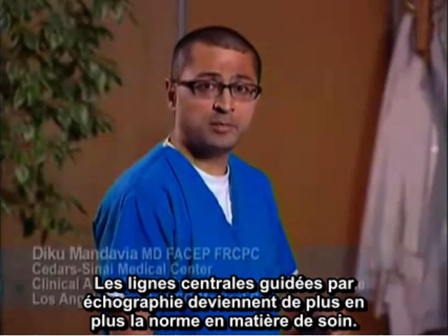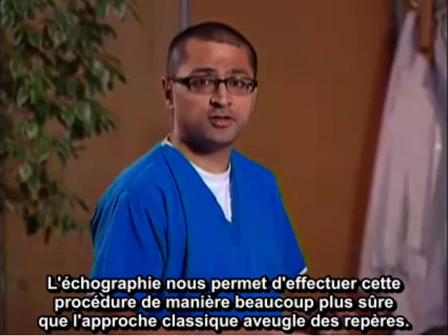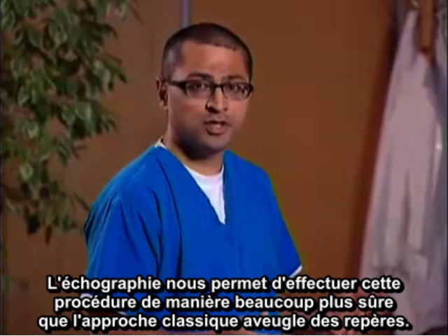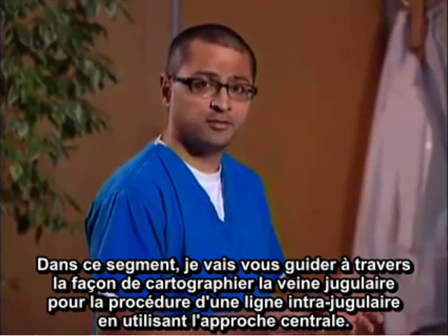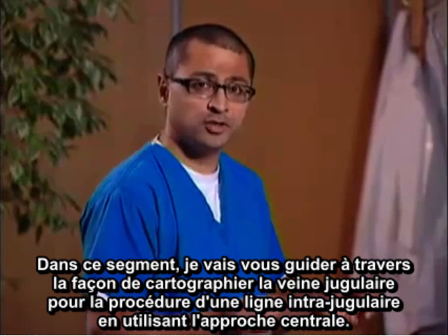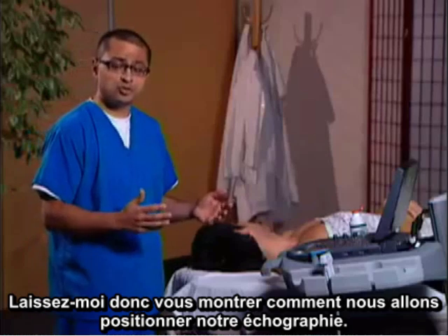Ultrasound-guided central lines are rapidly becoming standard of care. Ultrasound allows us to do this procedure much safer than a standard blind landmark approach. In this segment, I'm going to take you through how we can map the jugular vein for the procedure of an internal jugular line using the central approach.